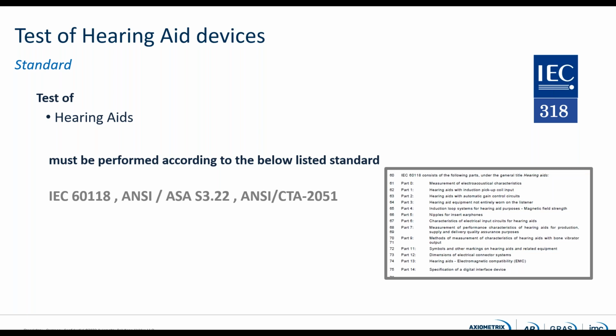When we are in the US, the ANSI standard is S3.22, or the ANSI standard CTA 2051.